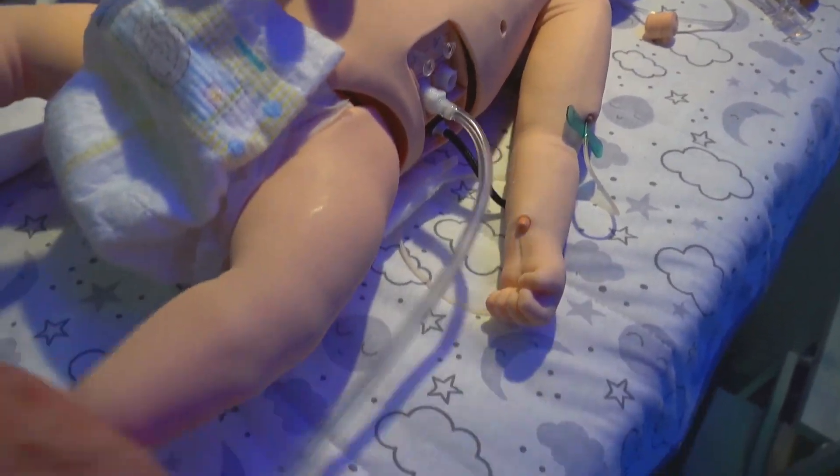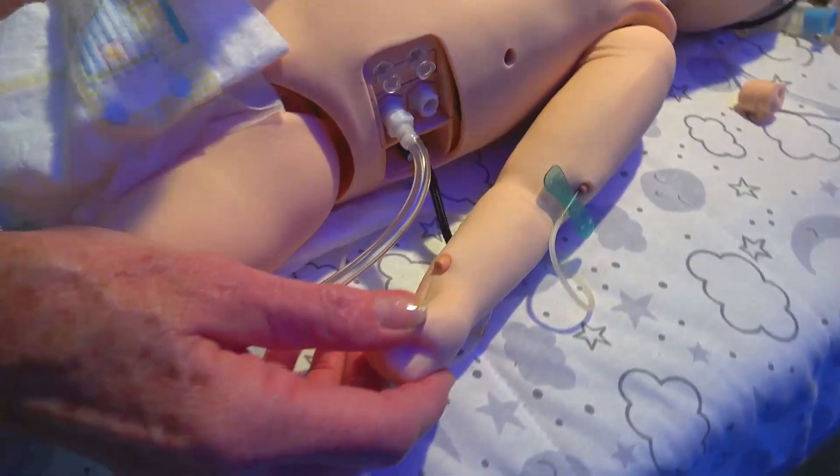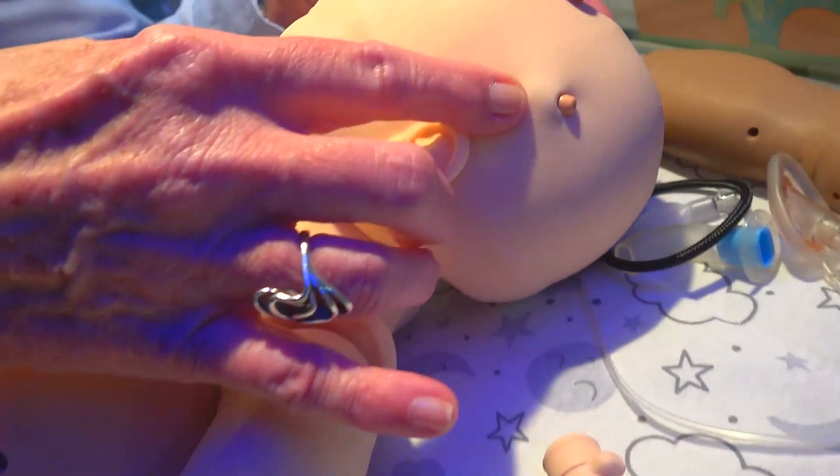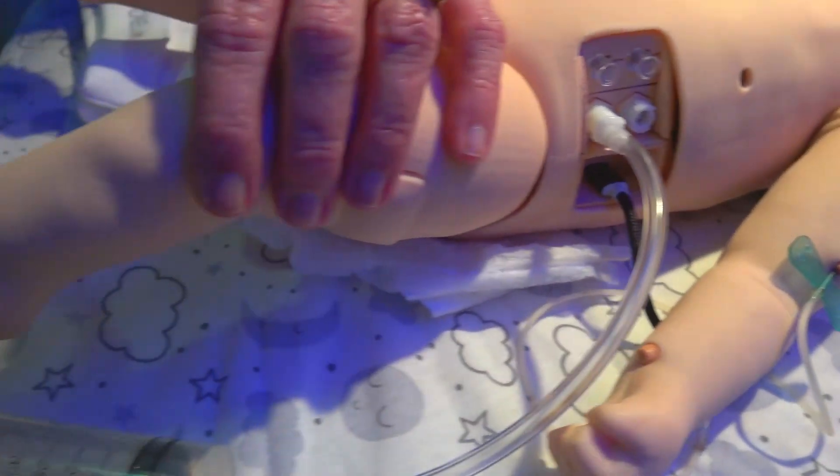Luna comes with three pre-ports for peripheral IVs. You have a brachial site, a temporal site on the left side of the head, and a site on the left foot.